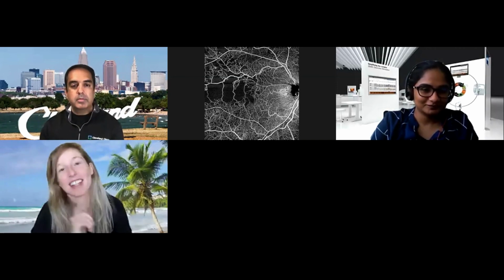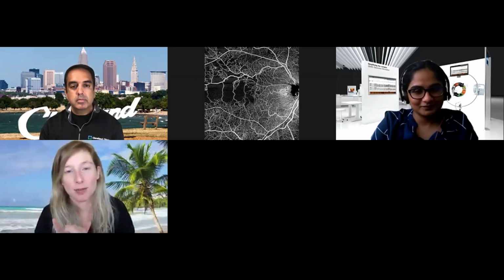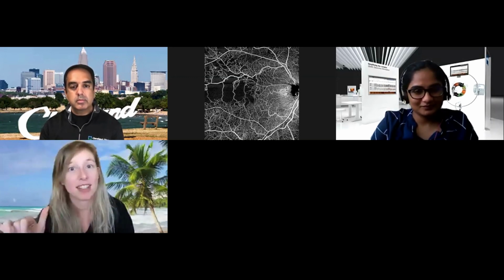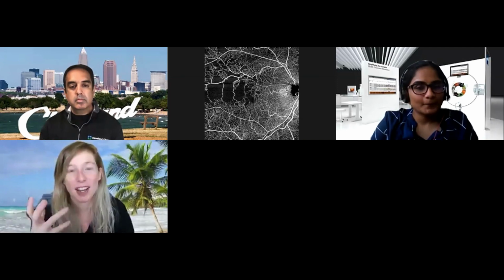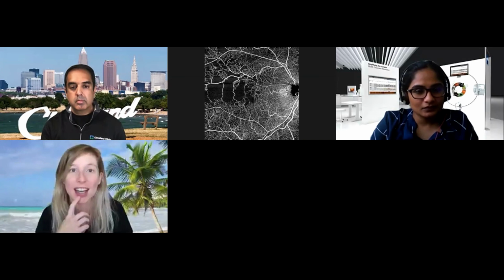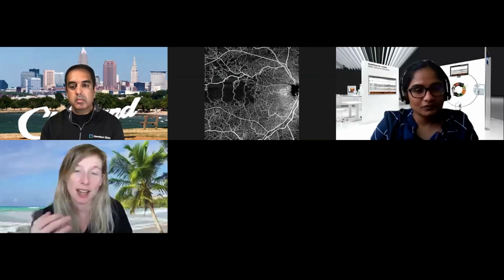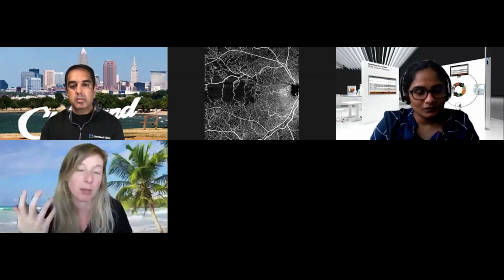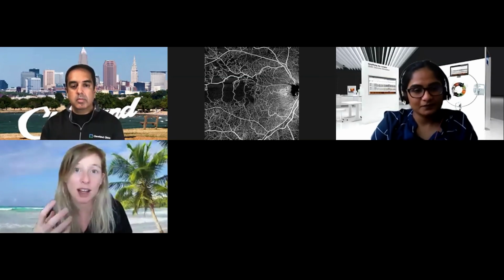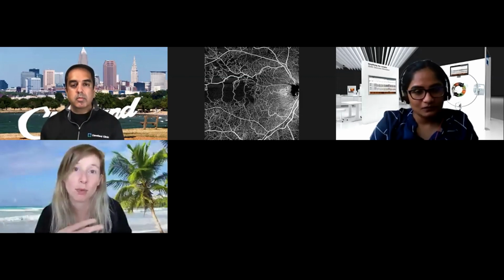One of the things that I think is really interesting with the OCTA is the ability to do direct comparison. So one of the areas that I'm really excited about is looking at vascular networks and seeing how they change with VEGF therapy, how those networks become less complex with time, even if they don't go away completely, and what we can use that information for to help direct prognosis.